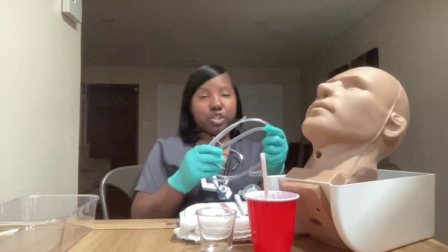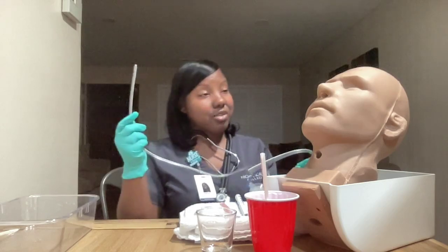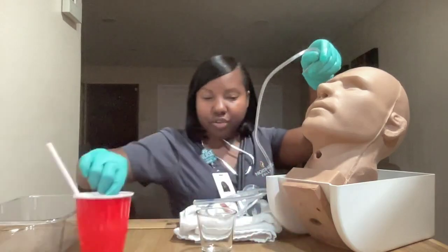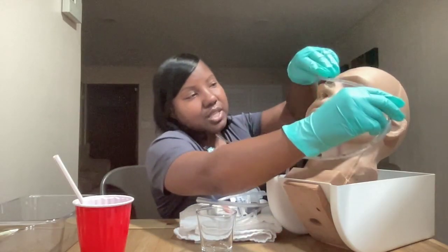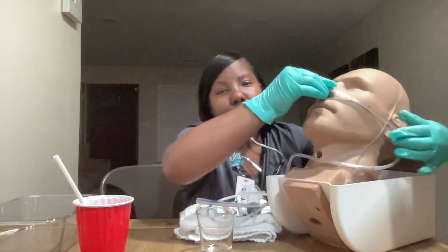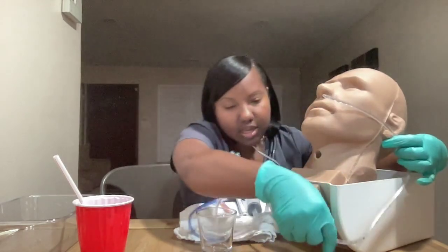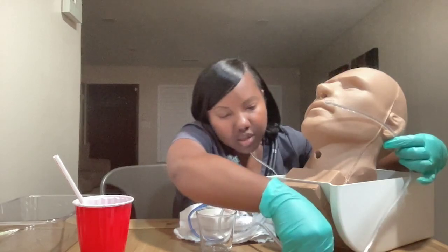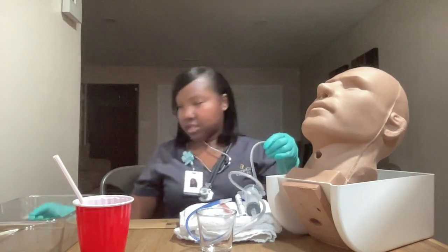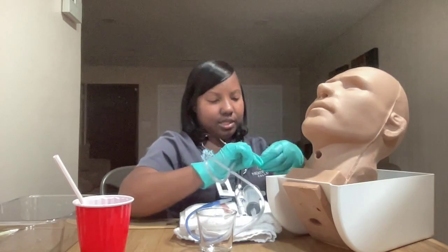I am going to first begin by measuring the tube. I want to determine how much I need to insert to reach the stomach area. To do that, I am going to measure from the patient's nose to the tip of their earlobe and then down to the xiphoid process. That brings me to 50, so I will mark this using tape so I know how far to insert.